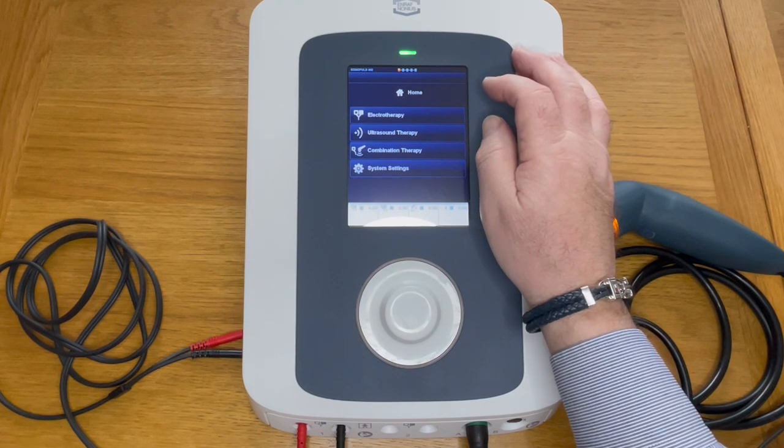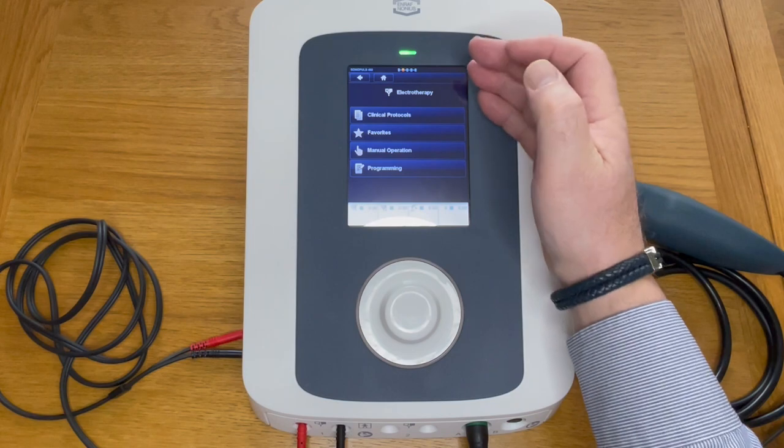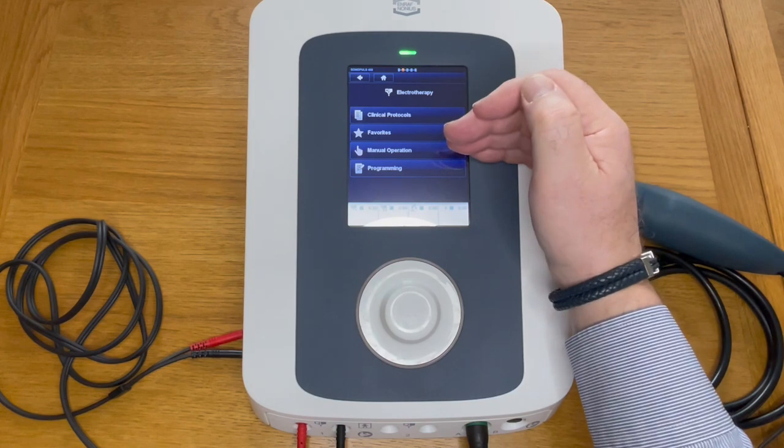Let's go straight into this. It's very simple — if we go into electrotherapy, you can see you've stepped down one more level and here you've got clinical protocols, favorites, manual operation, and programming.